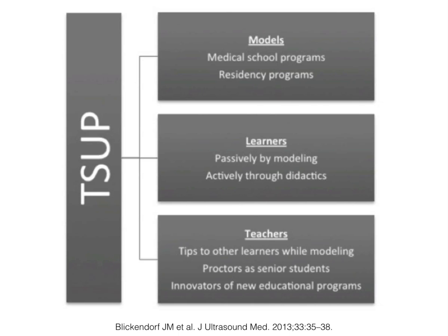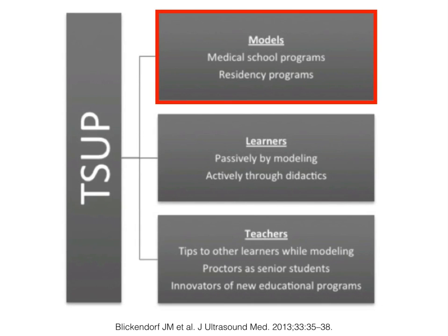If you look at Dave Bonner's program, he has the ultimate high fidelity simulator. He's got medical students. So real people are possibly sometimes the most high fidelity simulators, but there's just very little or no pathology. So if you're teaching about FAST scanning to recognize free fluid, while they may be the highest fidelity, they are not necessarily the best for that learning environment. Maybe a lower fidelity simulator that shows free fluid might be better in that learning context. It depends on what your goals are.